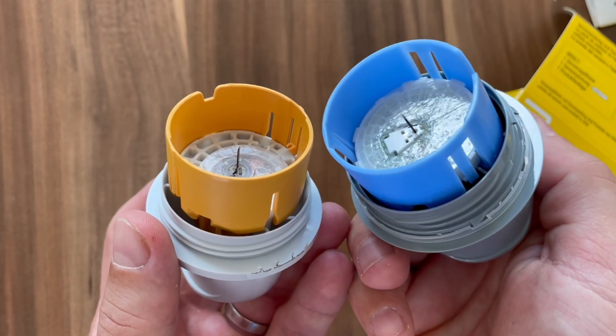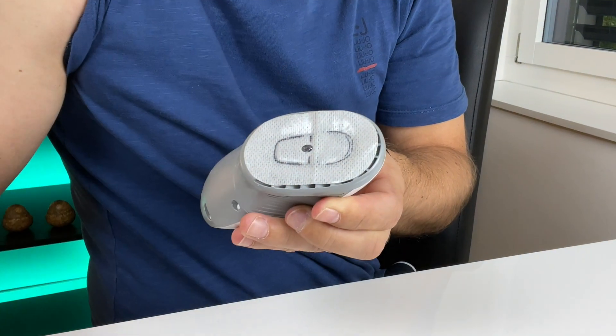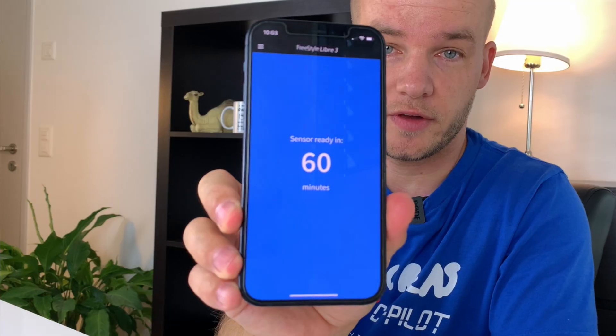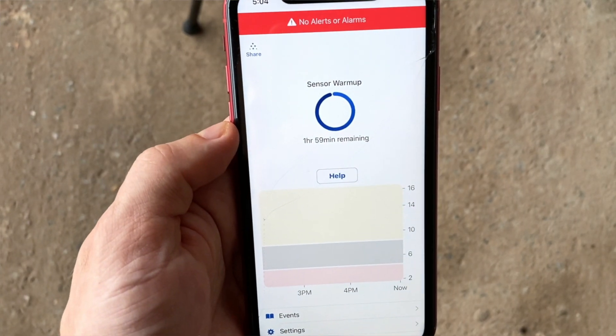A lot of you have been asking if the application is more painful with Libre or Dexcom — to be honest I really don't see any differences in that category. Libre goes in under a 90 degree angle and Dexcom under a 45 degree angle, but the application nor the removal of any of them is not really painful. Another important difference when it comes to site change is the warm-up time. The Freestyle Libre 3 warm-up time only lasts 60 minutes. The Dexcom G6 warm-up time is two hours.